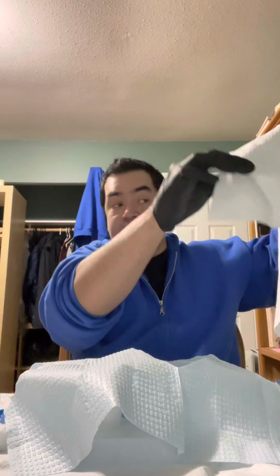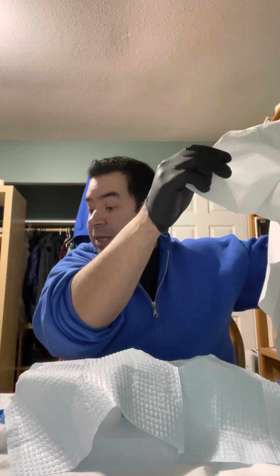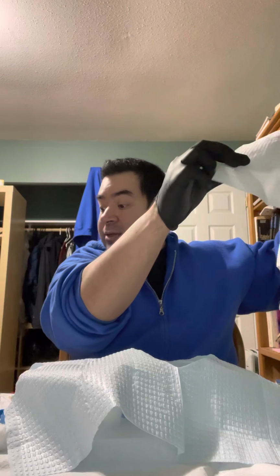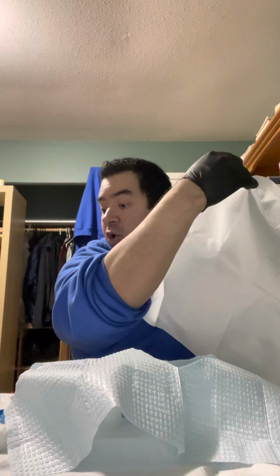I will then prepare to drape the patient's perineum while making sure my gloves stay sterile, so I don't touch any unsterile surfaces while wearing the sterile gloves. I'll continue by picking up the square drape, allowing it to unfold without touching any unsterile surfaces. And then I would place the drape shiny side down, just below the patient's penis, over the patient's thighs.